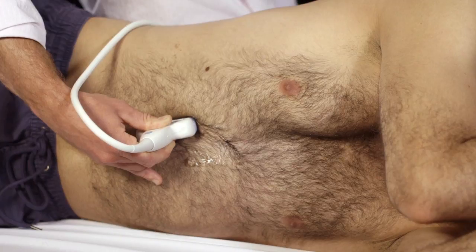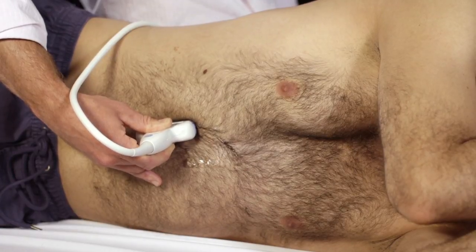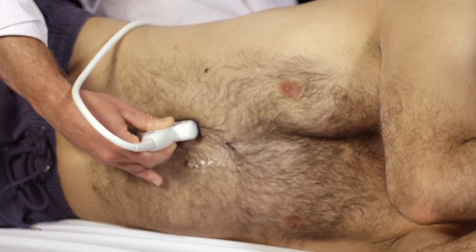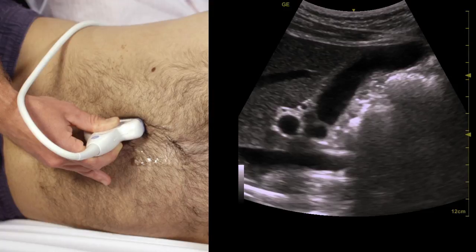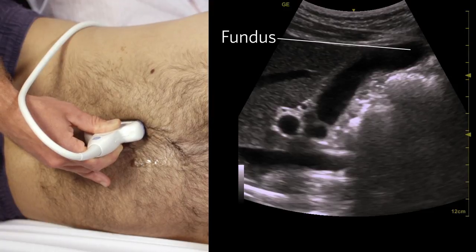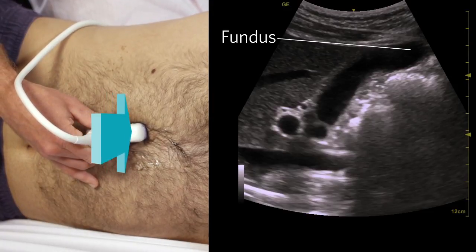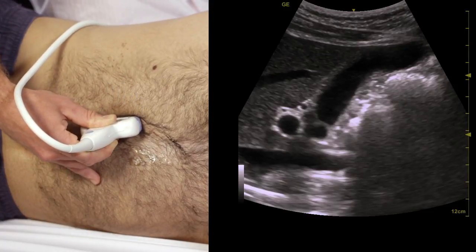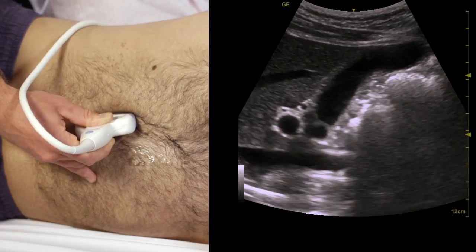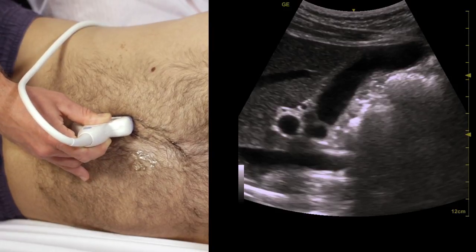You should also test for a sonographic Murphy's sign. This is an acute tenderness on compression of the gallbladder with your ultrasound probe. To test for this, find the fundus of the gallbladder with the ultrasound and apply pressure here. A positive sonographic Murphy's sign is found if this is the point of maximal tenderness.